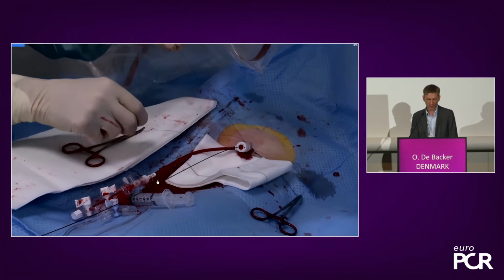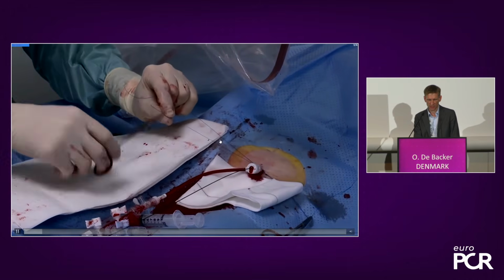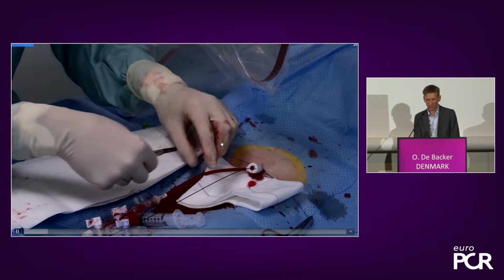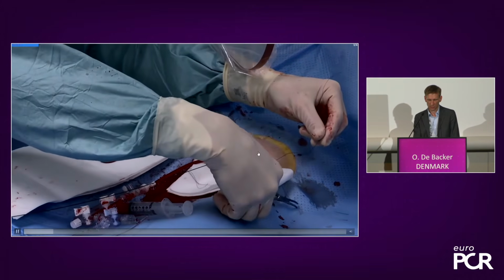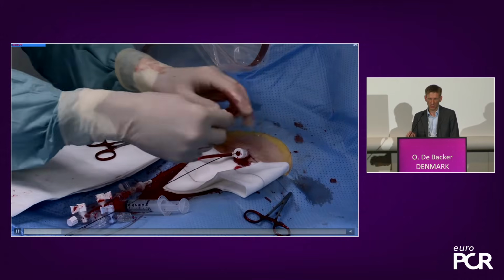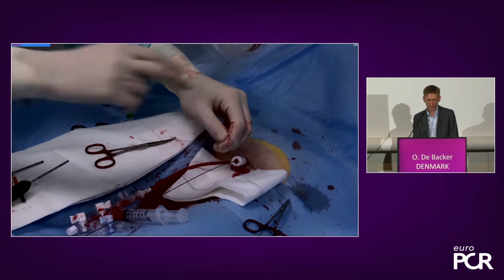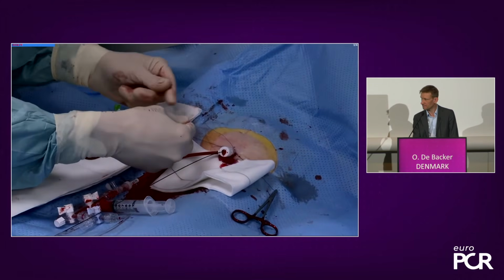So what we do is, this is now a case with 2 Prostyles. As you see on this one Prostyle, you have the short one and the long one. I think most of you know. We will do the pull on the long one and not on the short one. So I'm putting my forceps here on the short one. I already grab the long end of the suture around my digit finger. And you keep the suture, again, at 45 degrees?